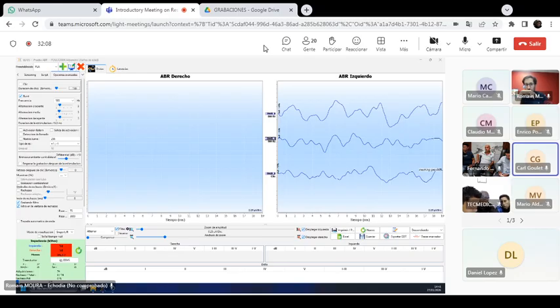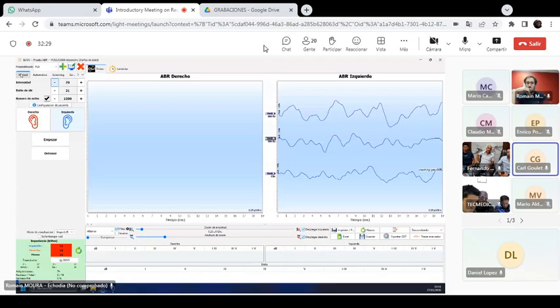But within the test, they don't need to meet those ranges, because they're asking for ranges that are completely out of spec for the ABR and ASSR tests. So we have an explanation there. We don't need to buy the audiometry license. No worry there. We have an explanation for the commission in that regard.